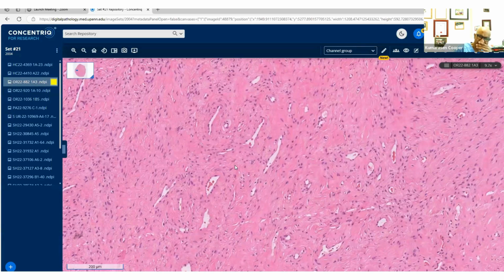And there are some things you can look at in your list and you don't use, like NSE. Some people have NSE still in their panels, or they even have Vimentin. Vimentin, sure, you can argue it's useful for distinguishing cervical adenocarcinoma and endometrial adenocarcinoma, but there are some antibodies you can get rid of that you don't need, and you can bring on these ones, which are helpful.